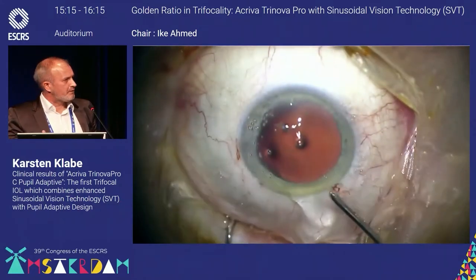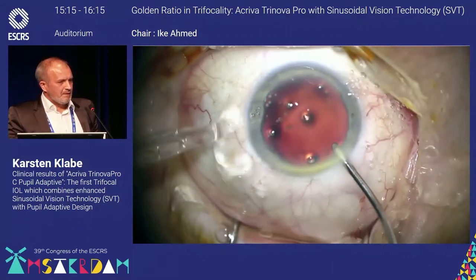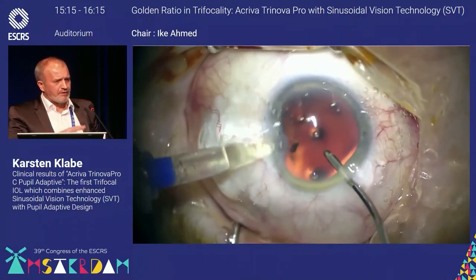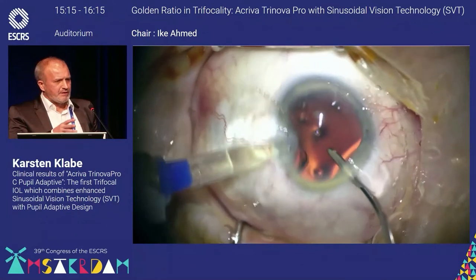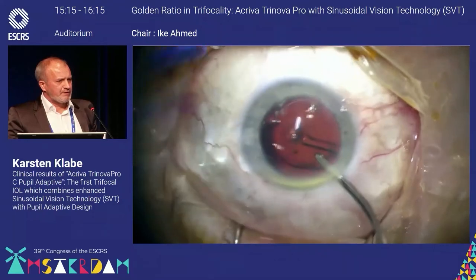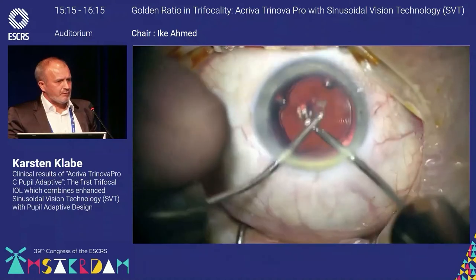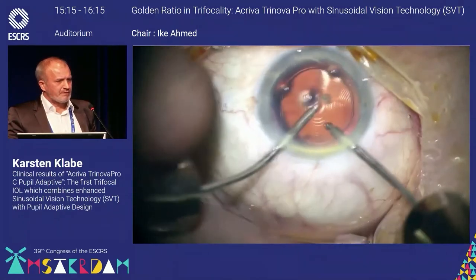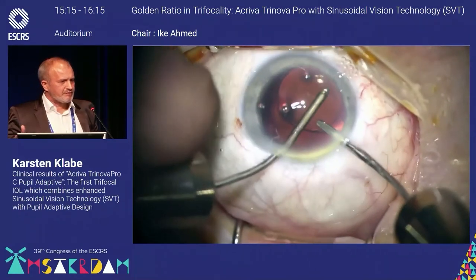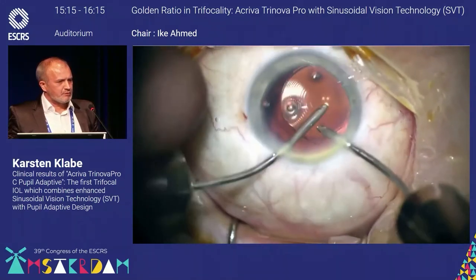So you see I'm doing it the first time, that's why it took a little longer. The feeling of the lens is a little bit more hydrophobic than hydrophilic. And you see it pops up like a hydrophilic, but it's a little bit stiffer in implantation than a hydrophobic intraocular lens, but it immediately centrates after opening the C-loop haptics. And there is only one step to go, removing viscoelastic, and that's fine. So you see, again, the immediate centration of the lens.